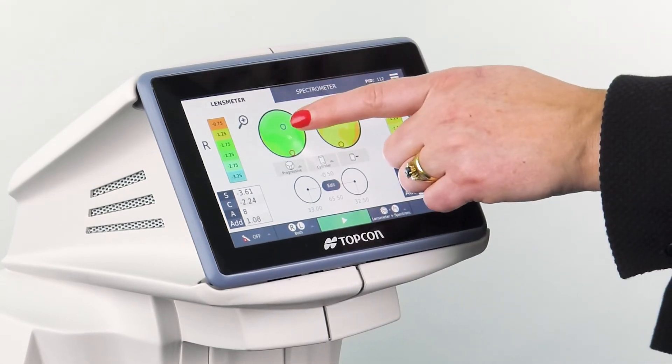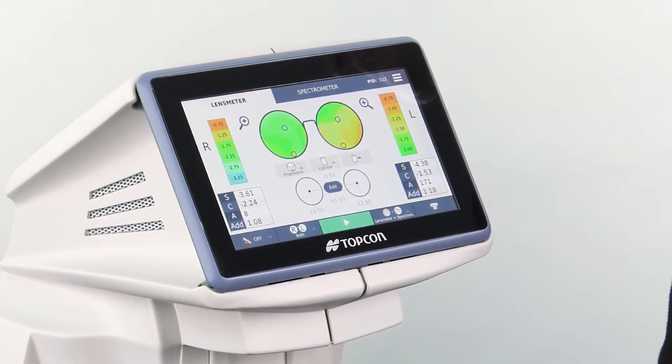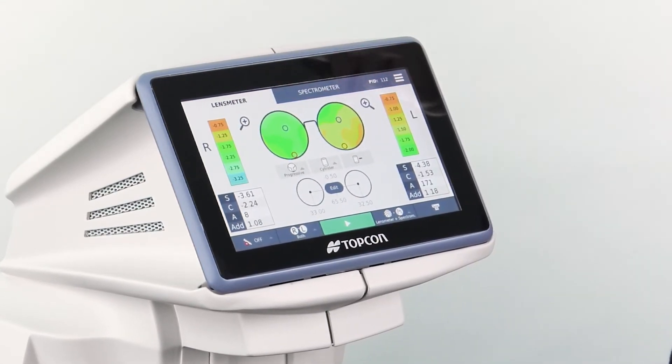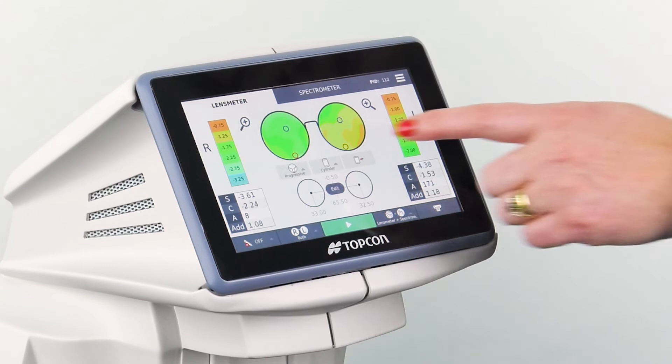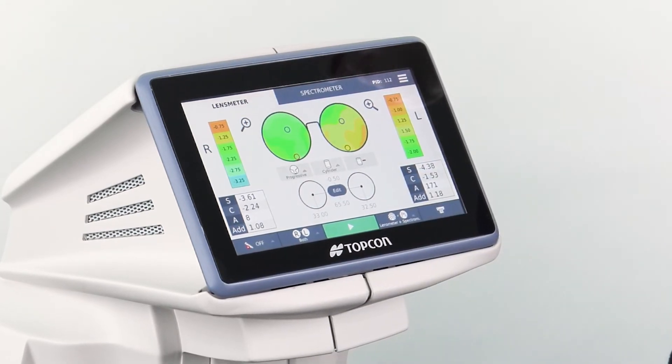The blue circles show the optical centre of the lens for distance, and the red circles is the optical centre for near.